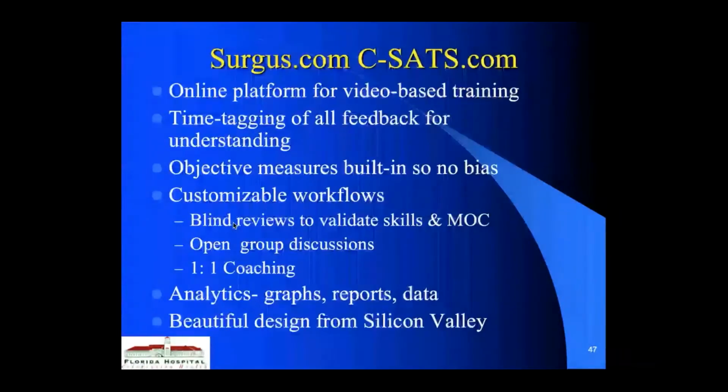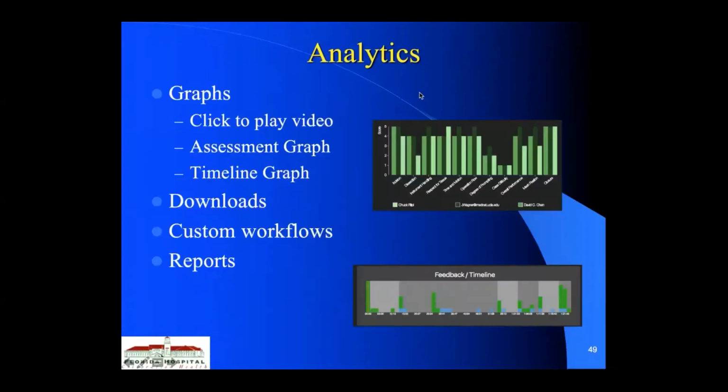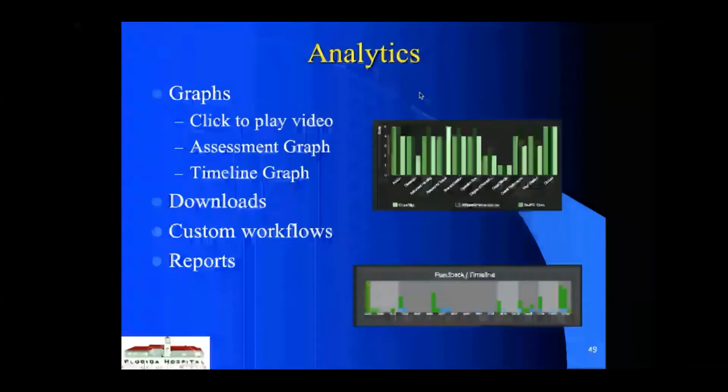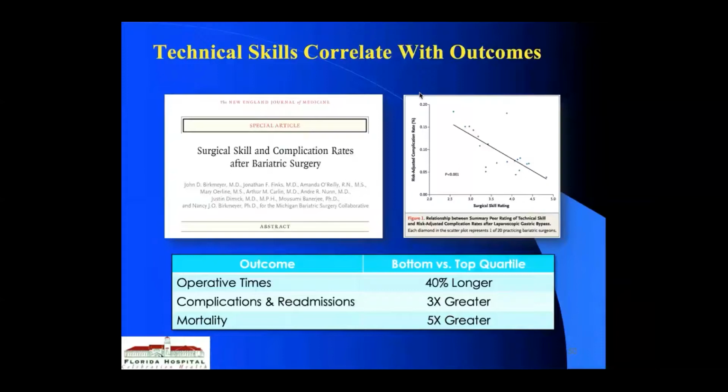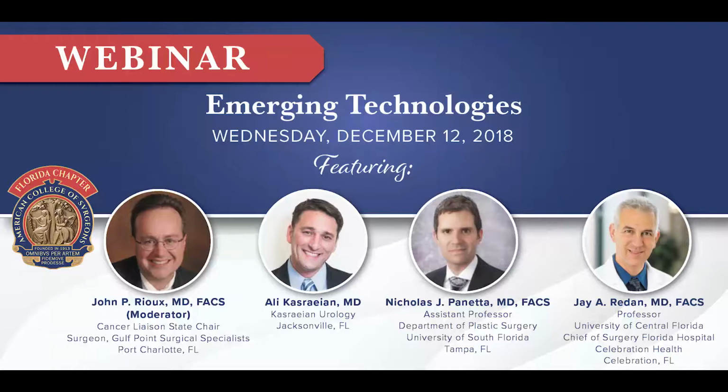There are several different organizations out now that will help train in robotics and give video feedback, again, through secure web servers where you can actually upload the videos and your skills will be scored so you can learn from each other. There's lots of different data analytics that will help play into the outcomes as we move forward. There's certainly a lot of literature coming out on surgical skill and complication rates, and how we can decrease this through video feedback and artificial intelligence and acquiring knowledge from robot to robot, surgeon to surgeon. So that's just a very quick overview of what is going on in the future.